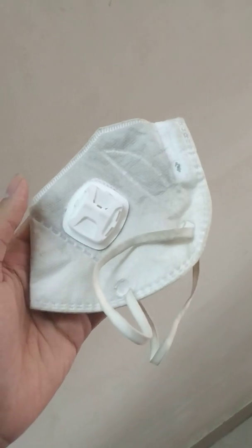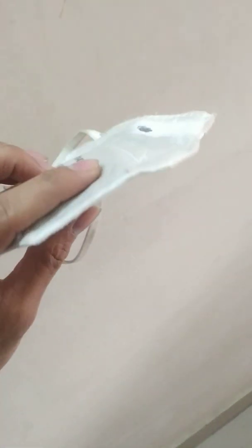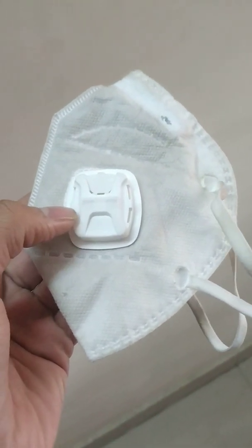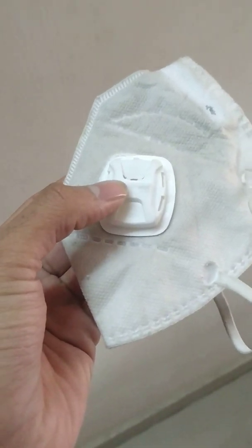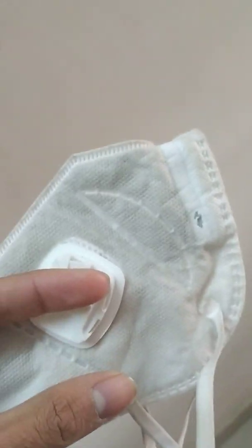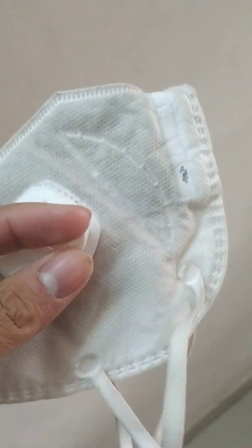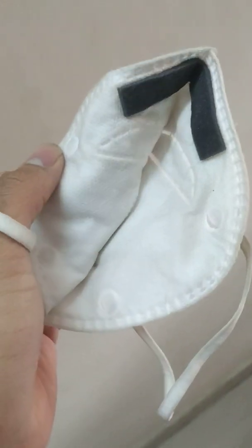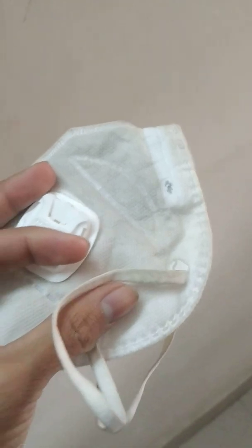This is a used Honeywell N95 mask, and I'm going to see what's inside it. You can see the exhaust valve for easy exhalation. This mask has been used, and you can see there are so many black and dark spots on it — this is due to the smoke in Delhi.